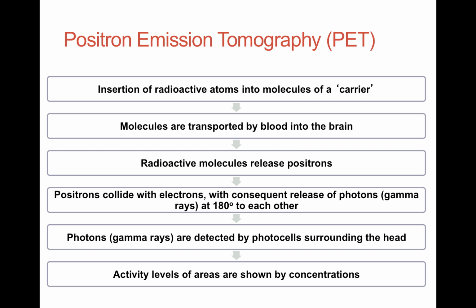The radioactive tracer is injected into the body, which then rapidly gathers in the brain's blood vessels. When part of the cortex becomes active, the tracer moves rapidly to that place as the active neurons use up the glucose. The PET scanner slowly moves around the part of the body being examined.